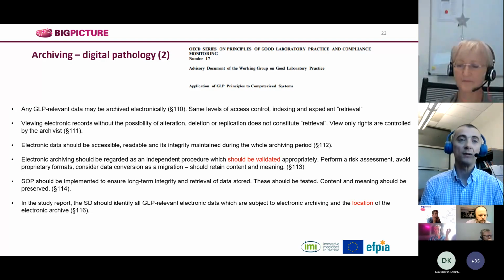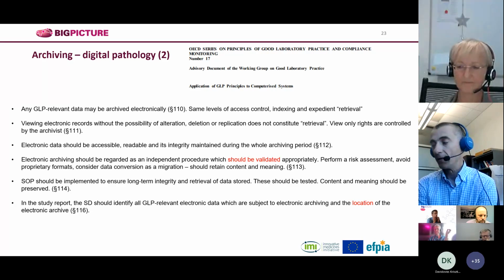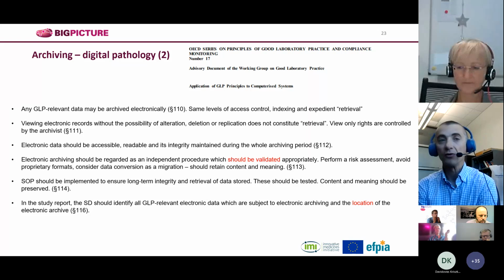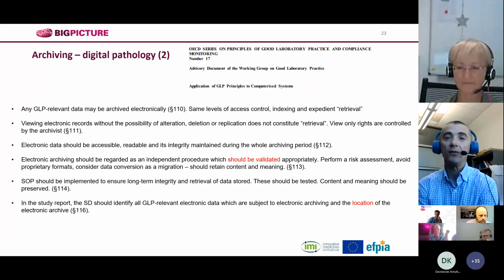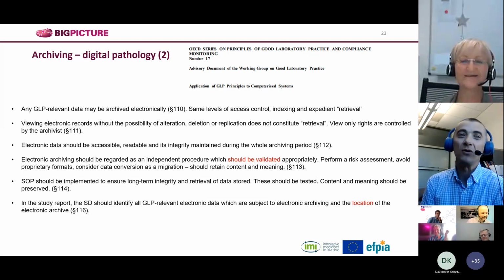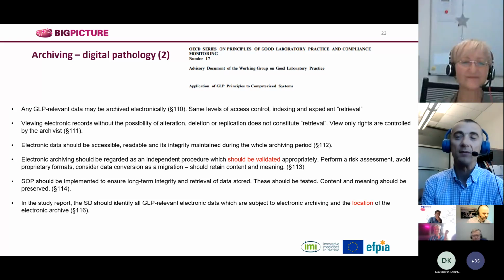So in general, the expectation will be that these whole slide images will follow the same durations as specimens. And so again, national jurisdiction, company policies. In my case, that would be 30 years. So if I'm to archive whole slide images, I want to be sure that in 30 years from now, if there is an inspection at Pfizer, hopefully I'm retired, but someone will be able to read and have access to the whole data without any alteration. So this is the expectation.